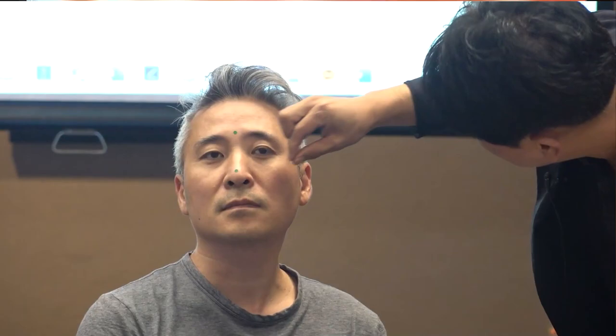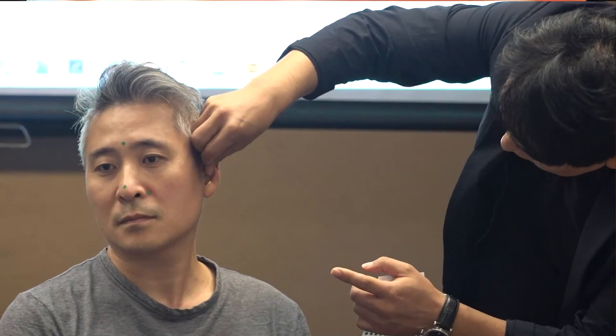Okay, ala and tragus. If you have a lot of experience, it's not necessary to mark this sticker in the paste. But now I want to show you, so I mark this camper's line perfectly.